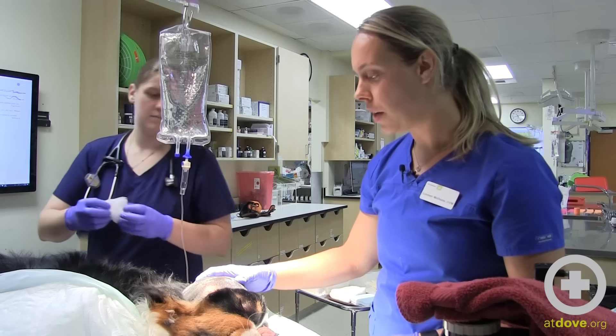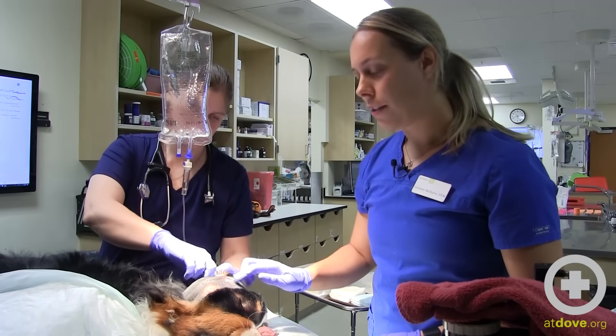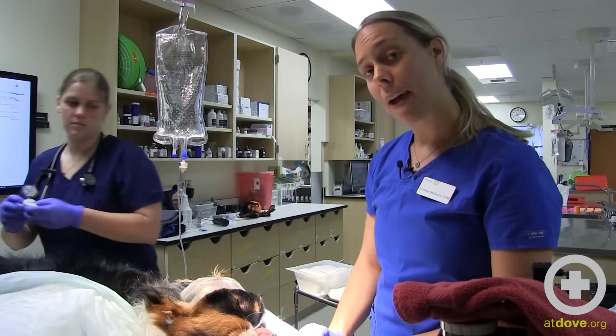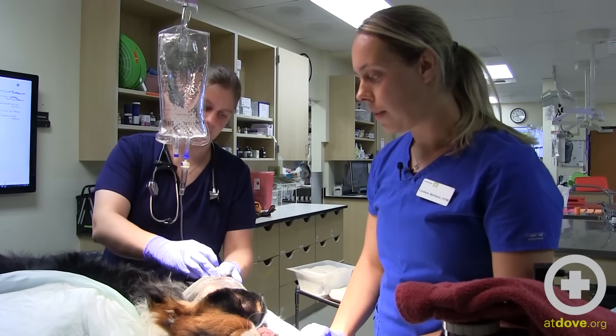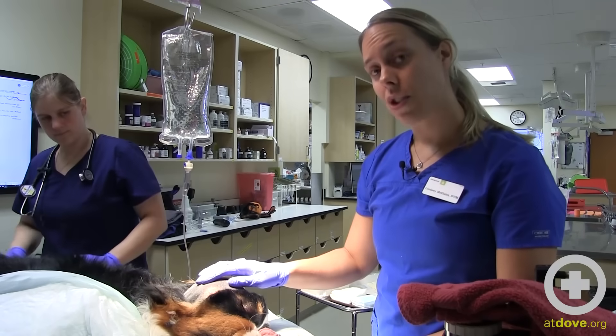We shaved the area and did a needle aspirate with a 20-gauge needle and a 3cc syringe, and got pus back. So we've now anesthetized her so that we can lance this, drain it, and flush it.